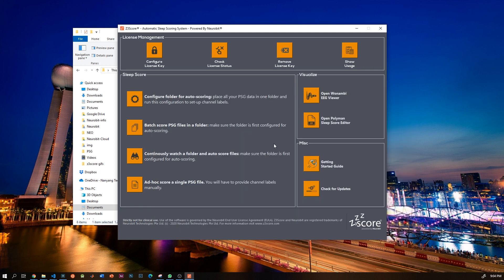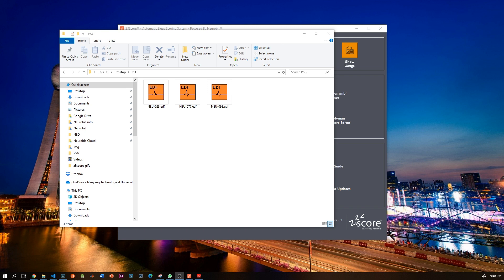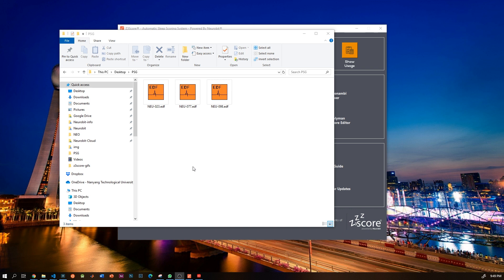Now that we are done with licensing, let's move on to sleep scoring. Most important step is to configure a folder for auto-scoring that makes it very easy to batch score data and continuously watch the folder for new data and score them as they come in, which is our no-click integration. So let's first create a new folder and put your EDF data in it. Ideally you should create one folder for each sleep montage. Try to have consistent channel labels so that the auto-scoring will work seamlessly.